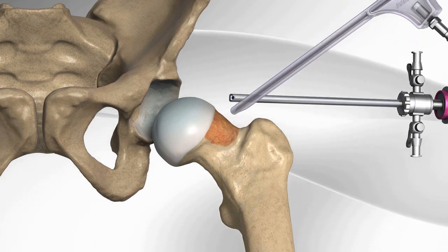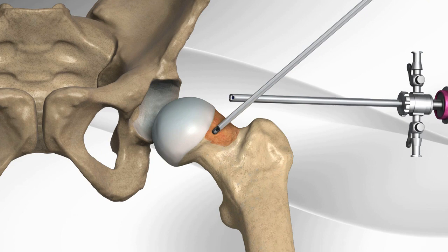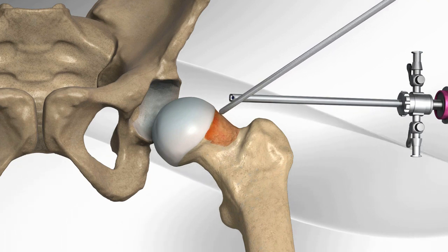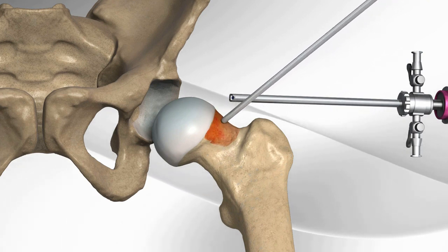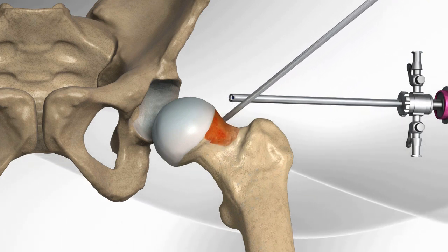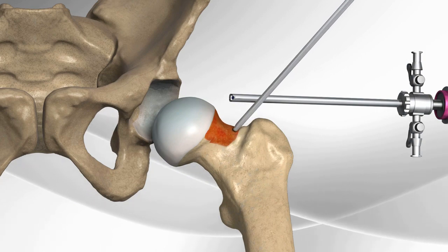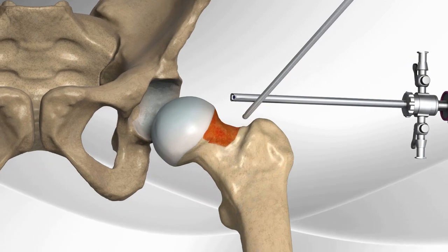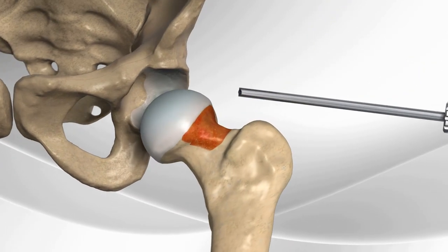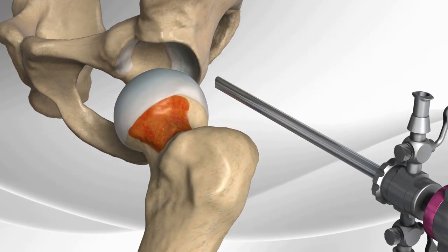The arthroscopic femoral neck osteoplasty is now complete and the normal bony contour of the head and neck is re-established. The hip is free to move without the cam lesion interfering with the normal range of motion.